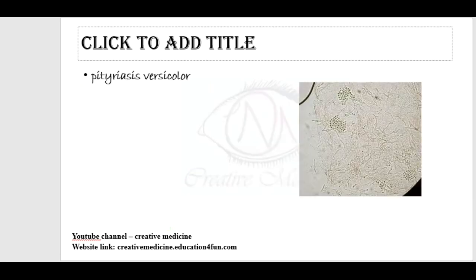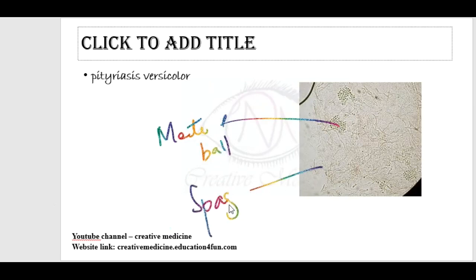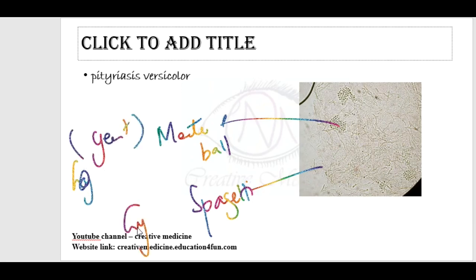Pityriasis versicolor on staining with potassium hydroxide smear, we see spaghetti and meatball appearance. Spaghetti is hyphae and mycelium, and meatball represents yeast cells. Malassezia is actually a dimorphic fungi, so it has both hyphae and yeast forms.